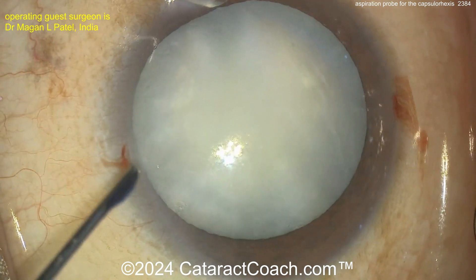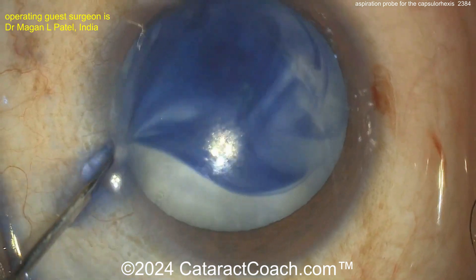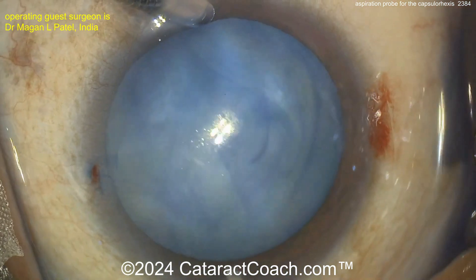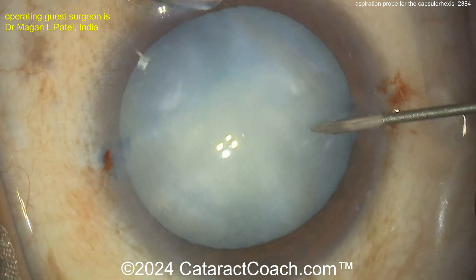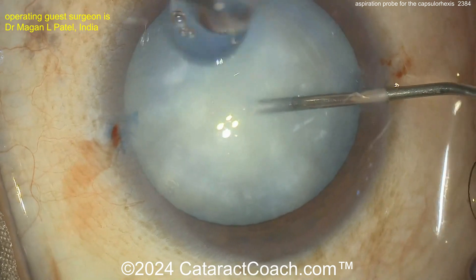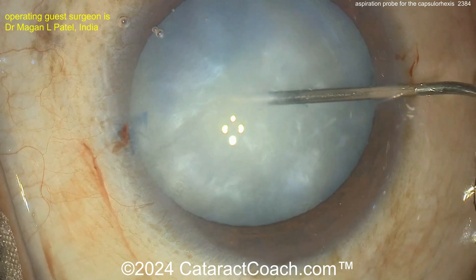These two small incisions go in. There's the Trypan Blue dye. With the AC maintainer, you may just wash it off, so maybe the AC maintainer is not on just yet. Now you're getting it washed out. And now poking into the anterior lens capsule — it looks like some aspiration, aspirating out some of that liquefied lens material, going all around to do that.